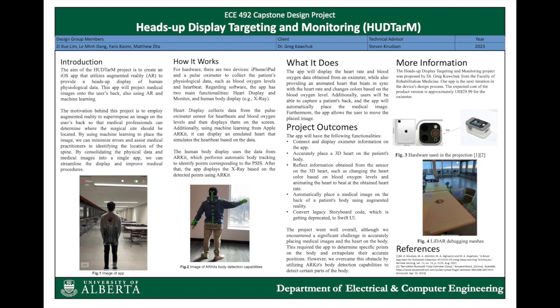So the purpose of this project was to build an app that uses AR to display human physiological data as well as projecting medical images. We started on an iOS app that runs on devices with LiDAR, so we could have curvature on our images.